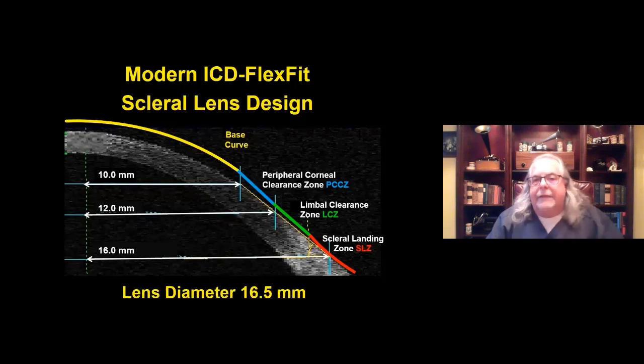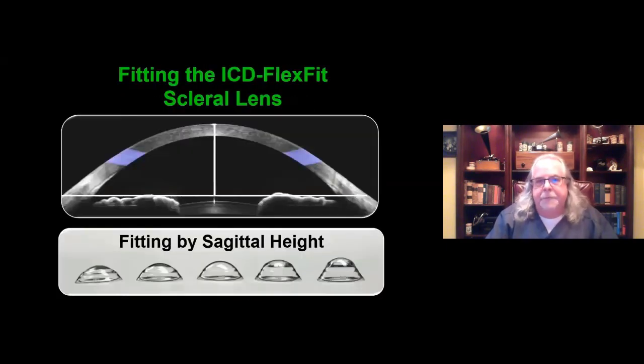What this did is it almost completely eliminated this lens tightening, which was so prevalent in our earliest modern scleral lens designs. Today, these really make up about 4 different portions of the lens. The anatomical features are things we're going to be discussing here in great detail in just a few minutes.